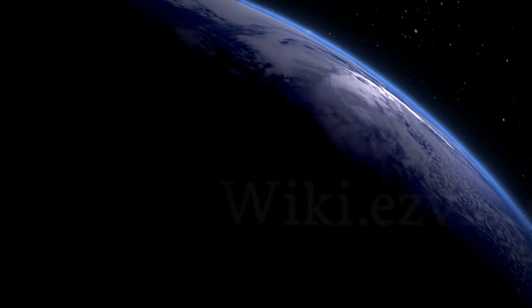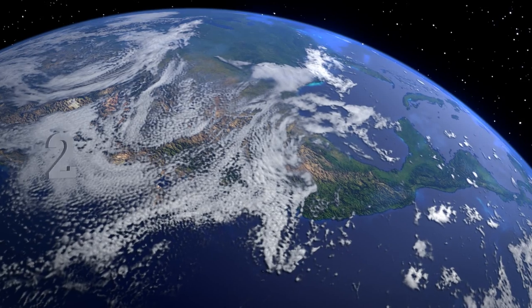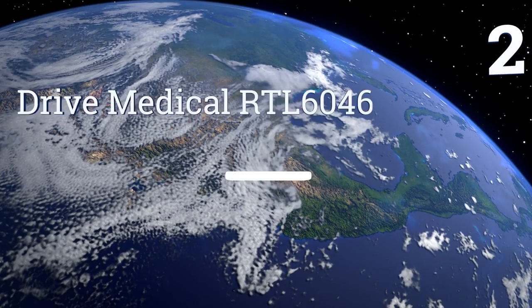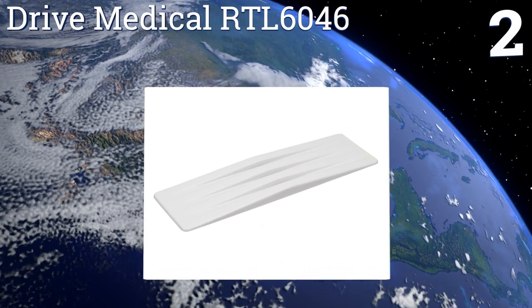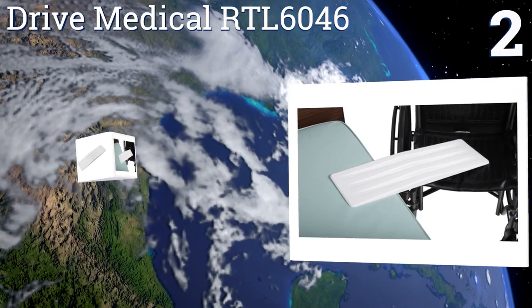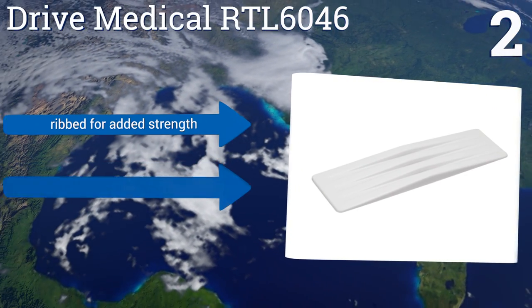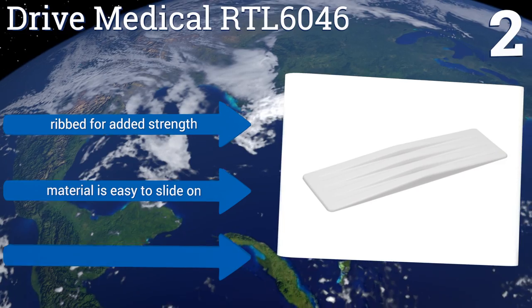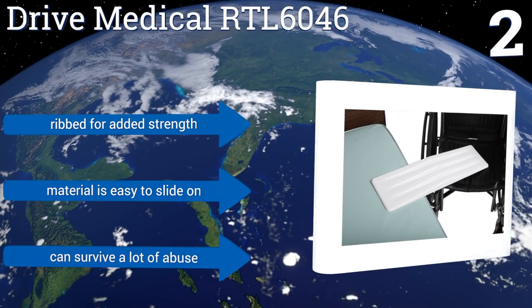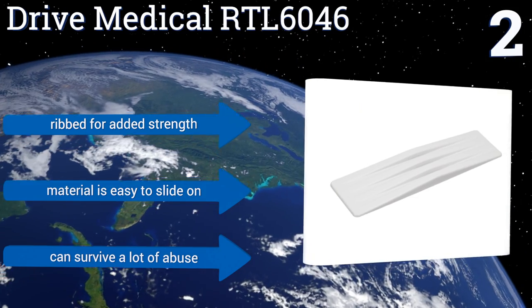It can support up to 735 pounds. At number two, the Drive Medical RTL 6046 is made out of non-absorbent plastic, making it a good choice for bathroom use as it can be easily wiped clean as often as needed. Plus, it won't soak up bacteria or grow mold, so it's a very sanitary option. It's ribbed for added strength, the material is easy to slide on, and it can survive a lot of abuse.